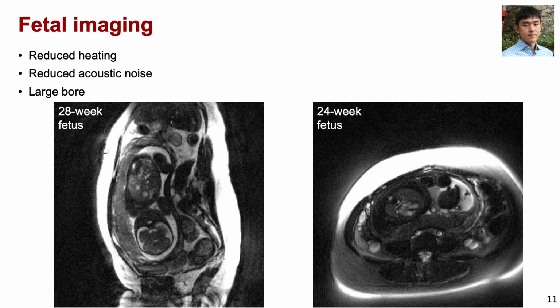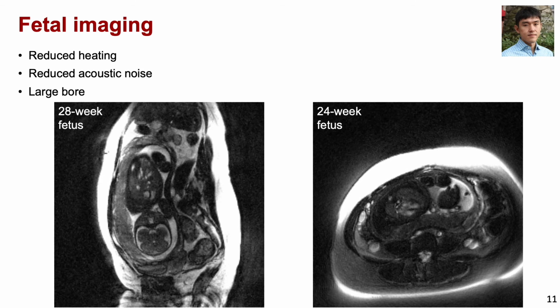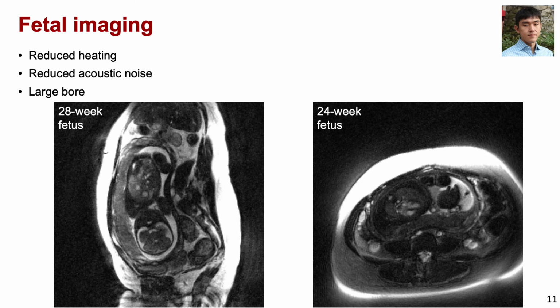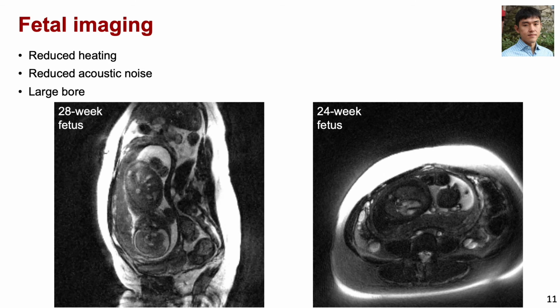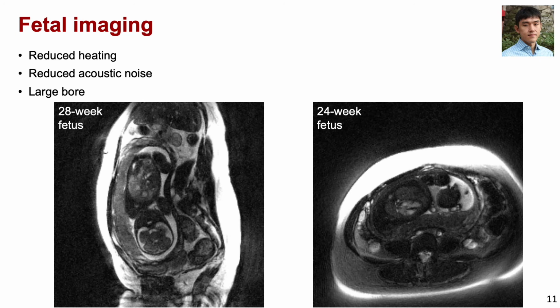And for certain patient groups, such as pregnant moms with a larger body size, we have a 70 centimeter bore, and the newer Free.Max scanner has a bore size of 80 centimeters, and this large bore size can fit the needs of all body sizes.